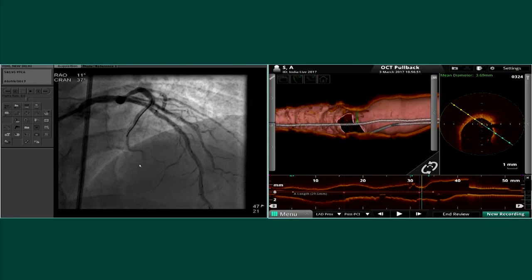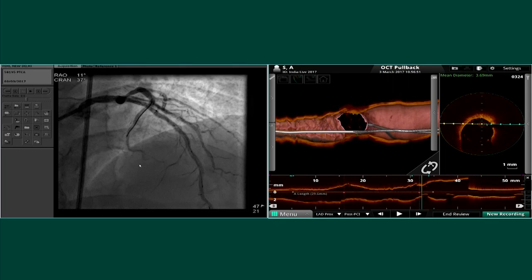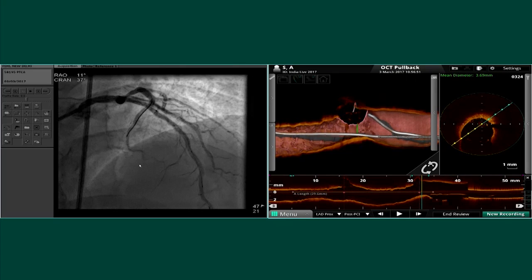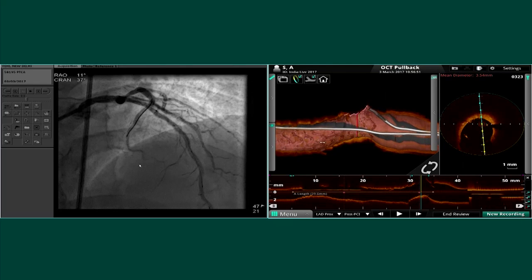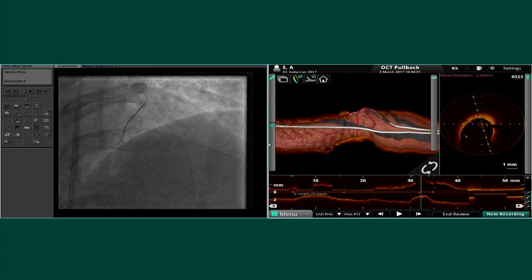You can see. That's the 3D reconstruction. What do you say? Yeah, I think at the upper side you can see partly the struts of the absorb are not so much visualized, they are not detected, but in a few rotations back you could see that opposite, they were not opposed. There was some distance between, so if you rotate again, continue the rotation.